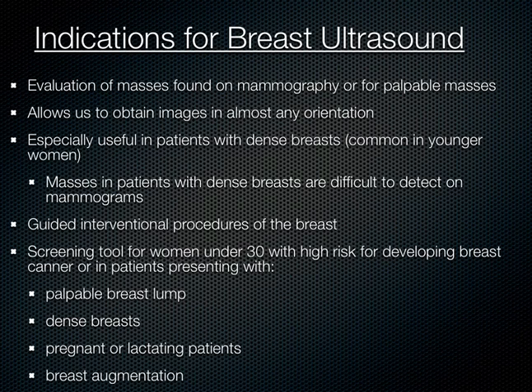First of all, anytime somebody has a mass that was found either through palpating their own breast, or a physician palpates their breast, or it was found on a screening mammography, this is another way to evaluate that mass, as you will see. And one of the advantages of ultrasound is that it allows us to scan in any orientation we want, and to get a really good three-dimensional image in our mind, we may need to move that probe in many different planes in order to do that.